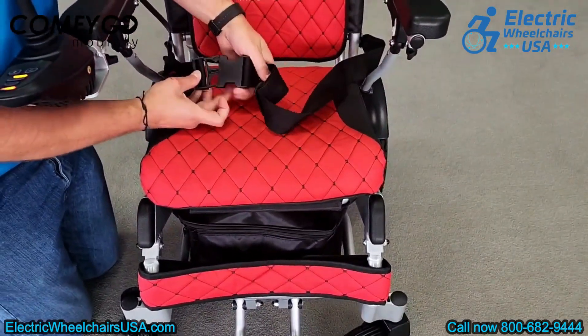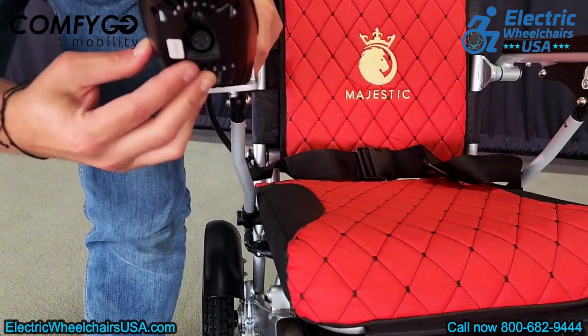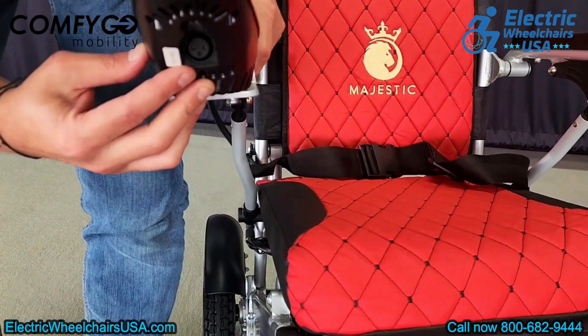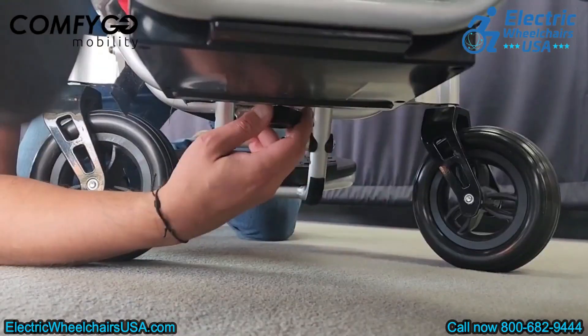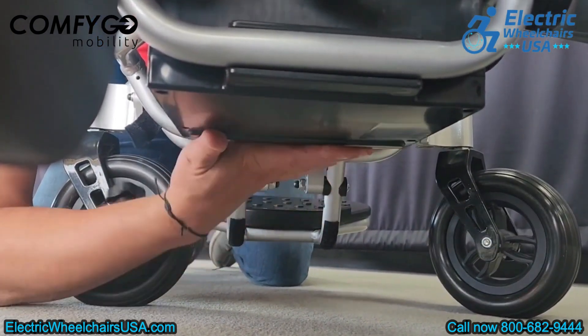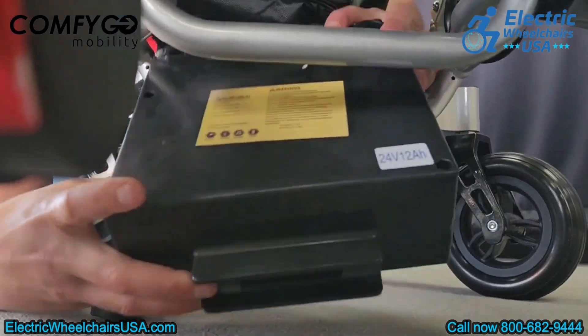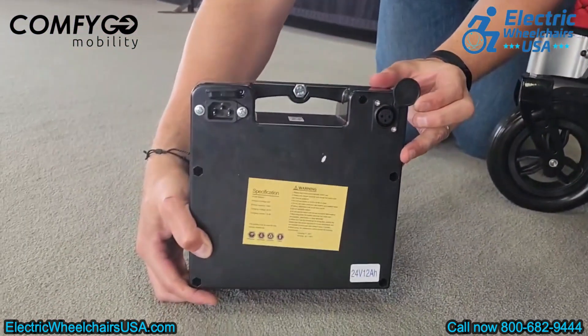It also comes equipped with a standard seat belt. You can charge the IQ8000 in two ways: directly through the charging port on the joystick, or by removing the battery pack and charging it separately. To remove the battery, simply unscrew the knob. Once removed, you'll find the charging port on the battery itself, allowing you to charge it indoors without bringing in the entire chair.